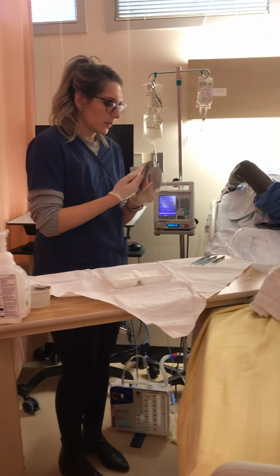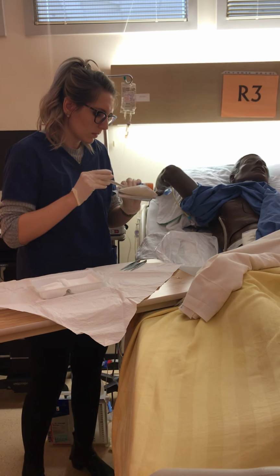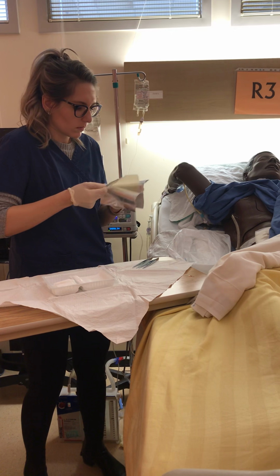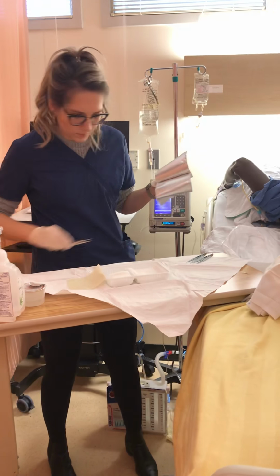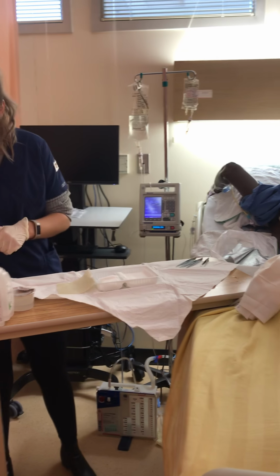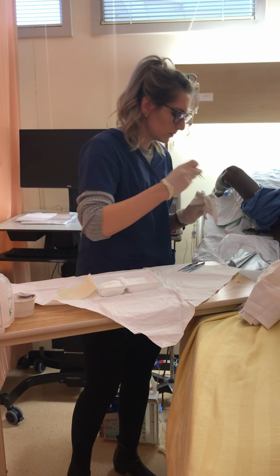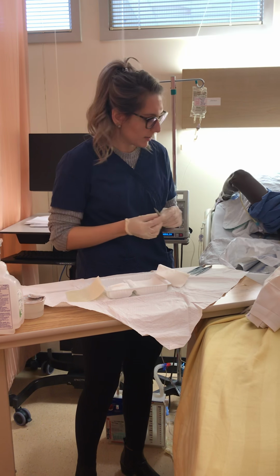So I'm just going to open my jelonet right now. Okay, so I will use the circle motion all the way around. Just add that into my sterile field. The tips of my forceps slightly touch the chest tube, so I can add my garbage. And I'm also going to grab my drainage site. We'll just verbalize that. That's in the garbage.